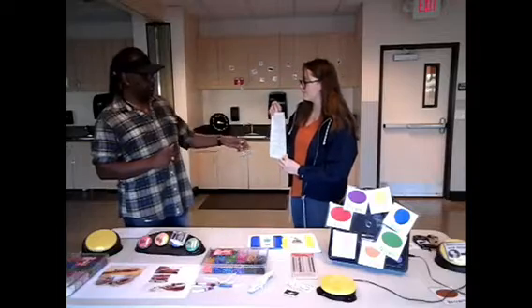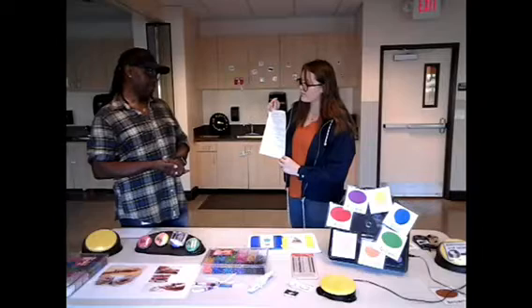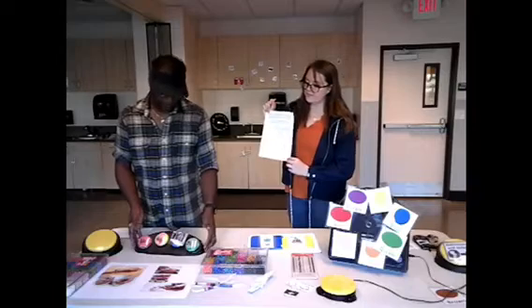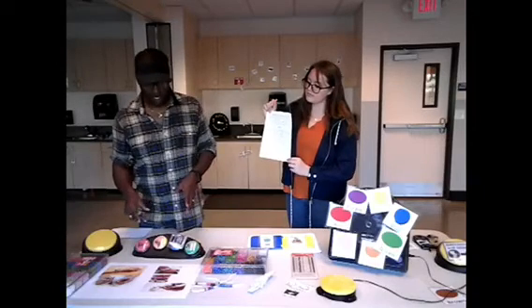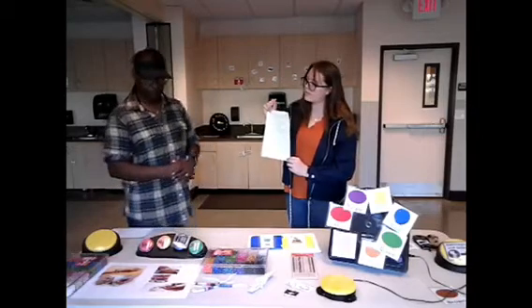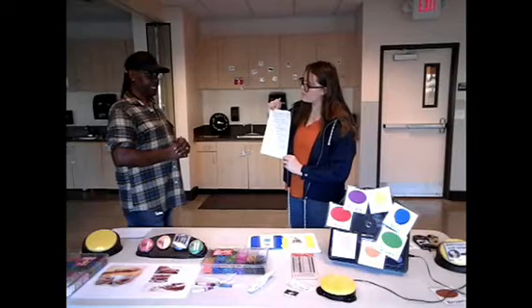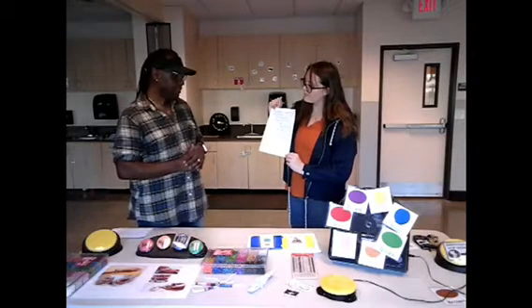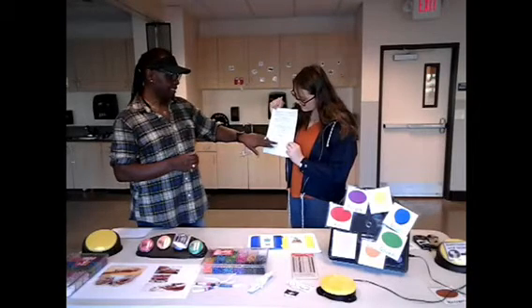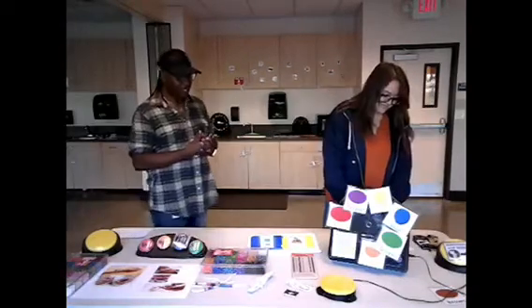Okay, let's see what this one talks about. Using signals to make communication more effective and meaningful. And that's why it's so important to place the switches in front of the consumers. They can see directly what you're talking about, and there's a correspondence to whatever the device or the choice is. Concentrate on the tone of voice when speaking. Consider context. Practice, practice, practice. Use appropriate language. Use decision-making ideas. Okay, got that down.